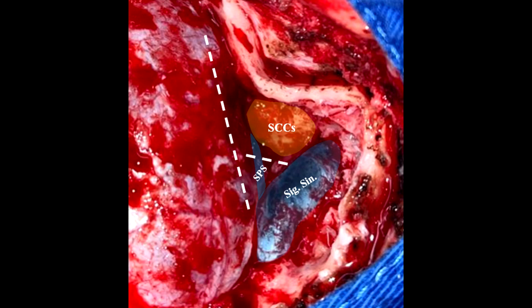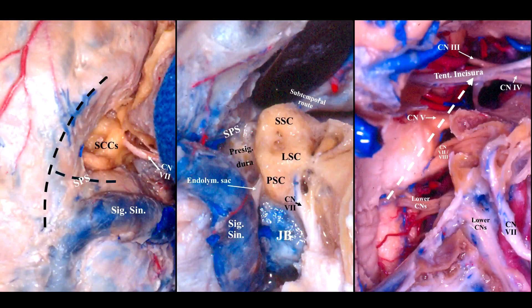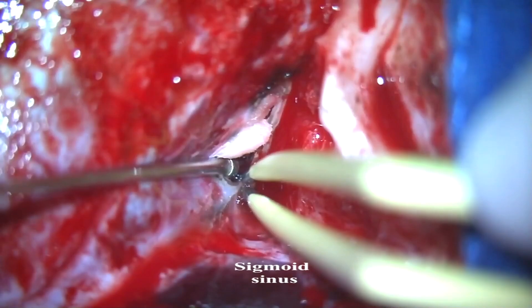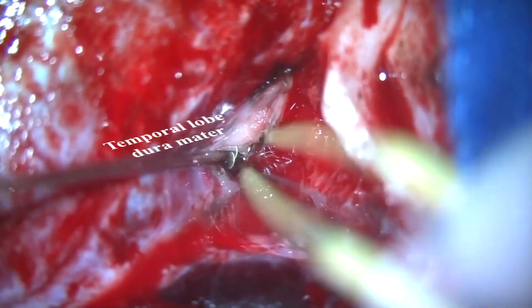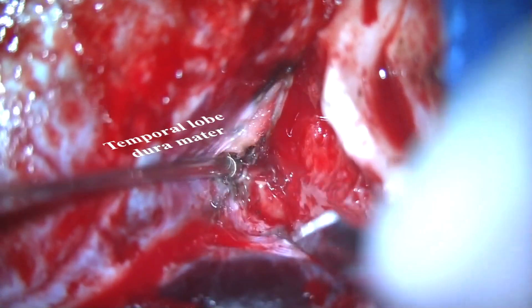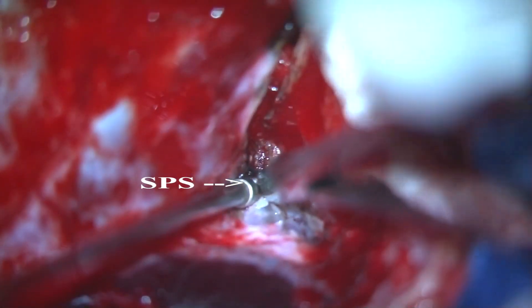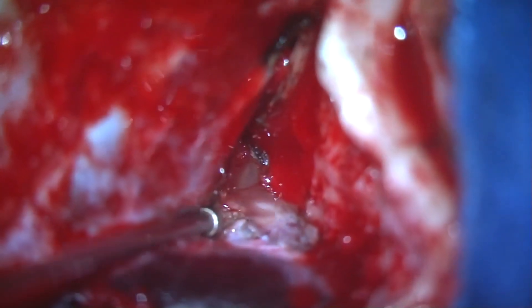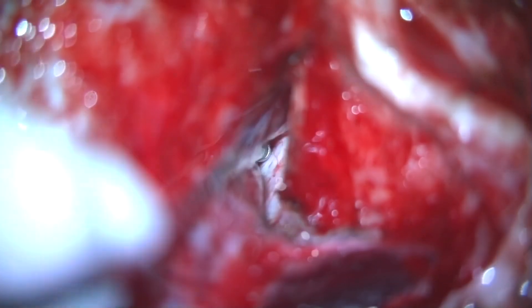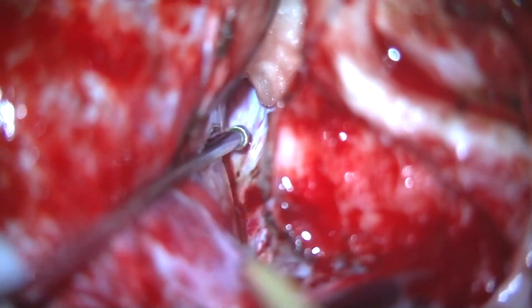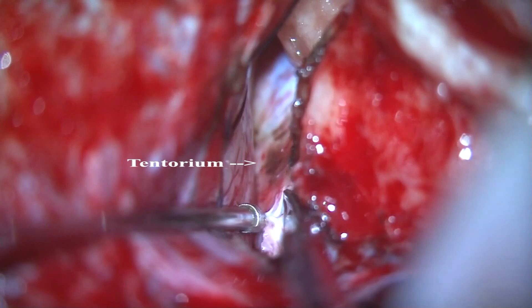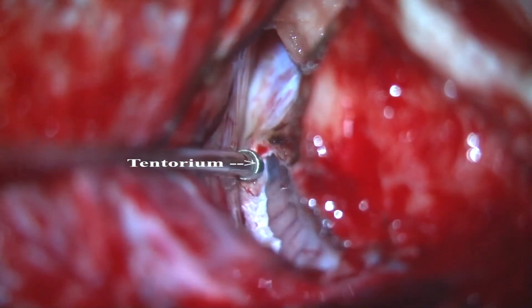The dural exposure is completed and the dural incision is depicted, better demonstrated by anatomical illustration. Initially, a small incision in the presigmoid dura is performed to drain CSF. Next, the dura at the base of the temporal lobe is incised, and the presigmoid dural incision is enlarged and connected with the temporal one, with coagulation and sectioning of the superior petrosal sinus between them. A small cotton piece is placed beneath the temporal lobe to help enlarge the subtemporal corridor while the tentorium is sectioned towards the incisura.